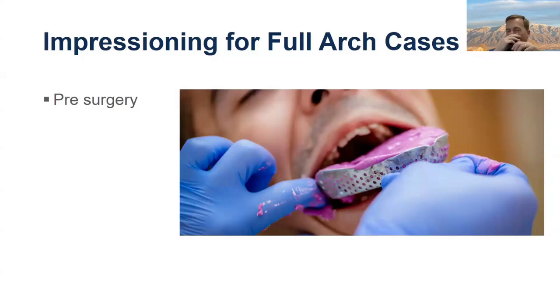So that needs to be really accurate. If we're doing digital workflows, we'll need to be able to align the files, so having a large file makes a difference. If you need a backup denture, you need a good enough impression to make an immediate denture. And especially with all on X, the whole ridge is nothing. It's no good for index. So a lot of times the borders are what we're using to actually index the case.